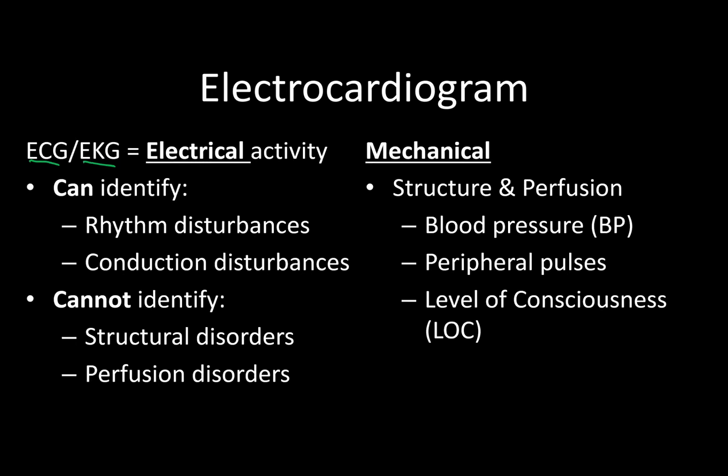Important other fun things before I delve any further. The guy who invented this is Willem Einthoven, and he did it back in 1901. He's the one that refined the machine and the process. He actually got a Nobel Prize for it back in 1924. So literally for over 100 years we've been doing EKGs on people to try and figure out how the heart works from an electrical standpoint. And in that time, here's what we've learned.